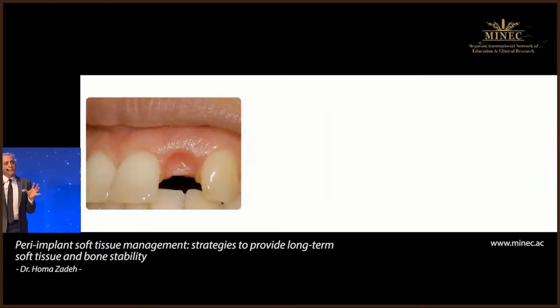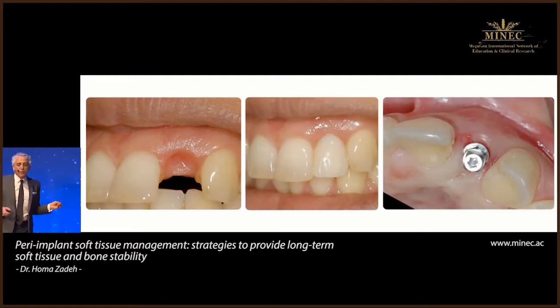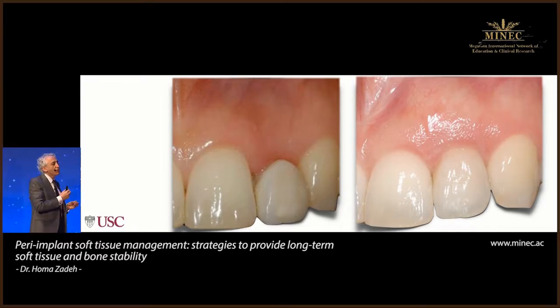You can see that you can really increase the mucosal contour by this technique, develop the ideal contour, and then in this case, the implant was placed later. Typically, we place the implant simultaneously with the soft tissue augmentation because of the logistics. We did it in 2 steps. So the benefit of Vista is that by making a vestibular incision, we don't have to make any surface incision in the papillae or the mucosal margin. So that way, the contour looks unaltered.